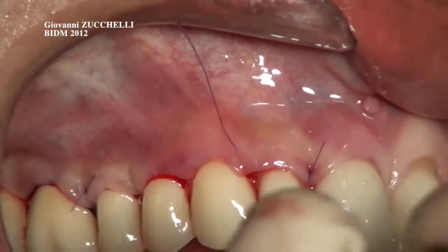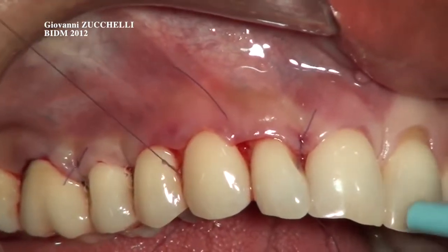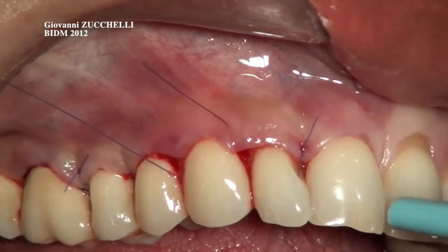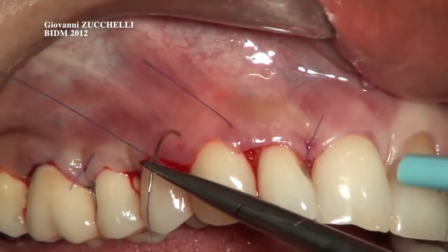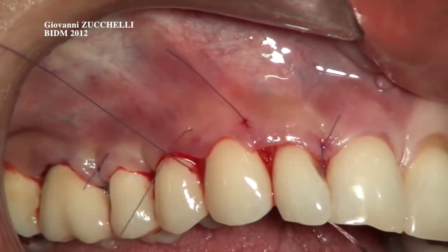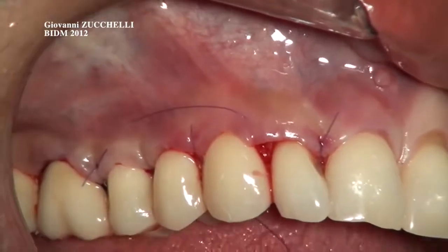Now go back, open a bit, below the contact point between the canine and the first premolar. You should check that the suture remains below the palatal cingulum. Again, surgical base, anatomic papilla, perforation towards the palatal aspect. Take the needle again from the palatal aspect. It comes back in the original position.